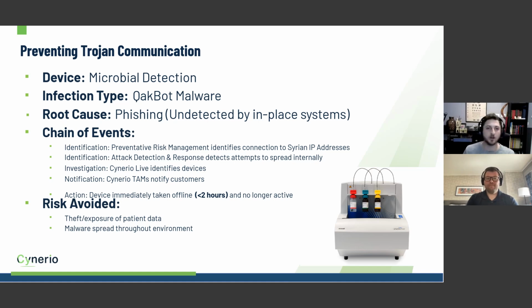Upon closer inspection, it was quite easy to notice that the additional traffic didn't just look strange, it was completely different from what we were used to from this microbial device in other environments. It looked completely different. And so we realized that this was basically another agent or another process going on within this device. We let the customer know quite quickly, within the hour or two.